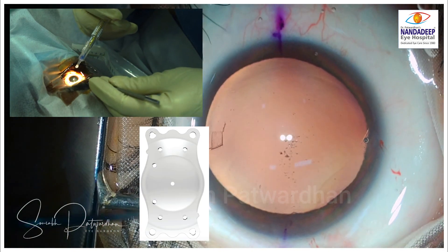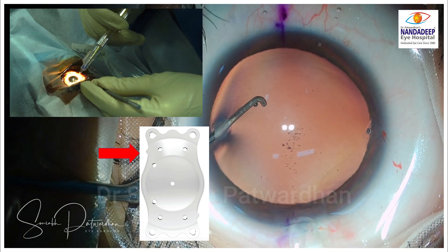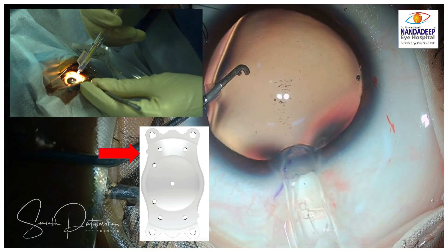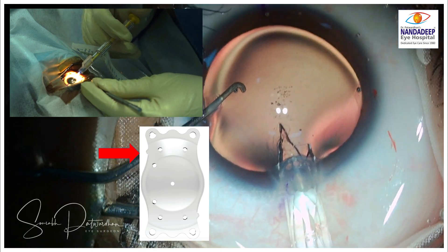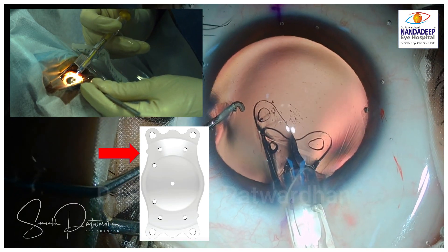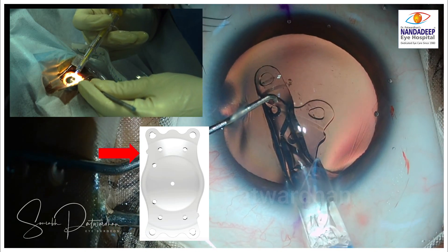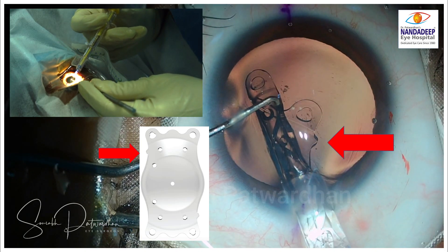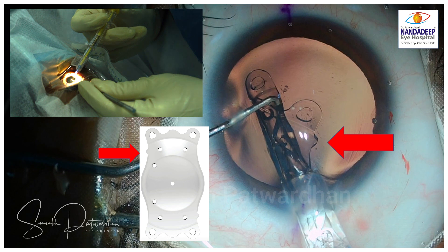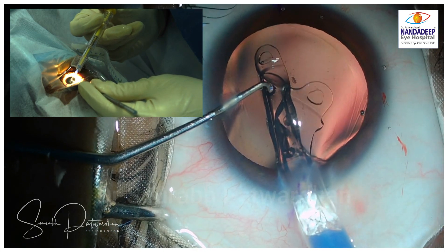This is the expected orientation of the IPCL inside the eye. You can see a small knob on the leading haptic which has to face on the left side. When I am inserting this IPCL, it has rotated a bit and is now facing on the right side. So if I push this IPCL now it is going to get inverted, and I don't want that.